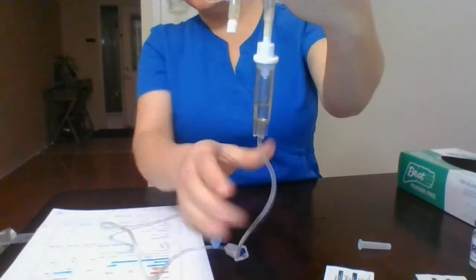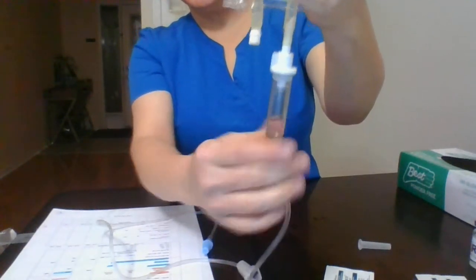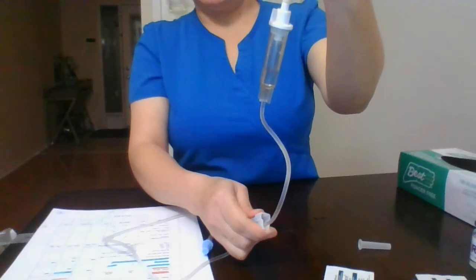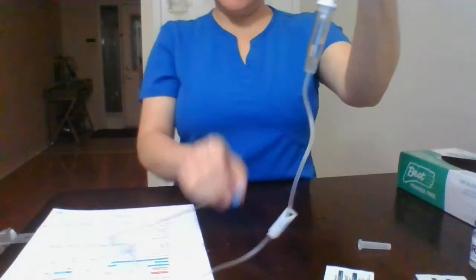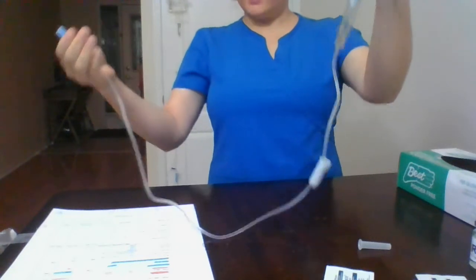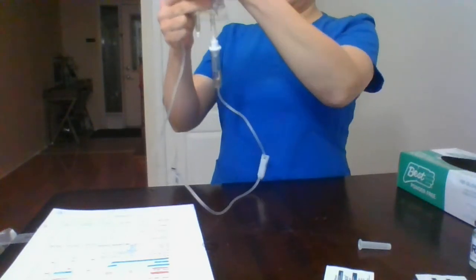Now we can see our medication is gently dripping. And I do not see any air in my tube. So we are ready to go and attach our mini IV to the primary port.